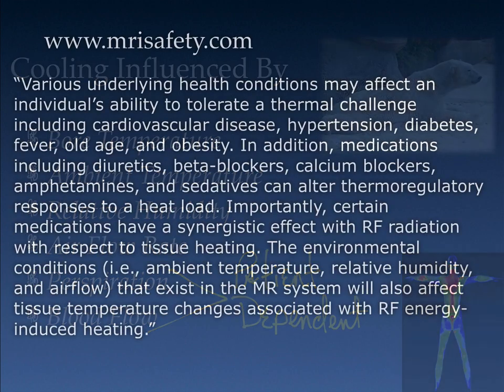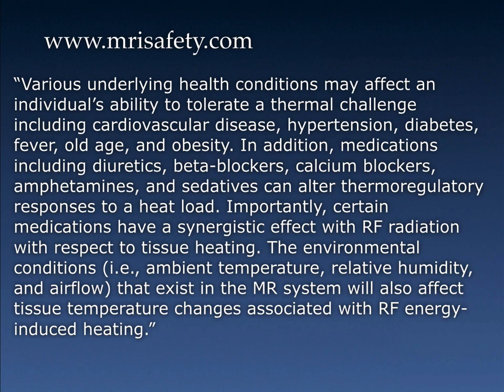On Dr. Frank Shellock's website, MRIsafety.com, he writes the following: various underlying health conditions may affect an individual's ability to tolerate a thermal challenge, and this would include cardiovascular disease, hypertension, diabetes, fever, old age, and obesity, a small subset of your patient population, I'm sure. And in addition, medications that include diuretics, beta blockers, calcium blockers, amphetamines, and sedatives. These can also alter a patient's thermoregulatory response to a heat load.